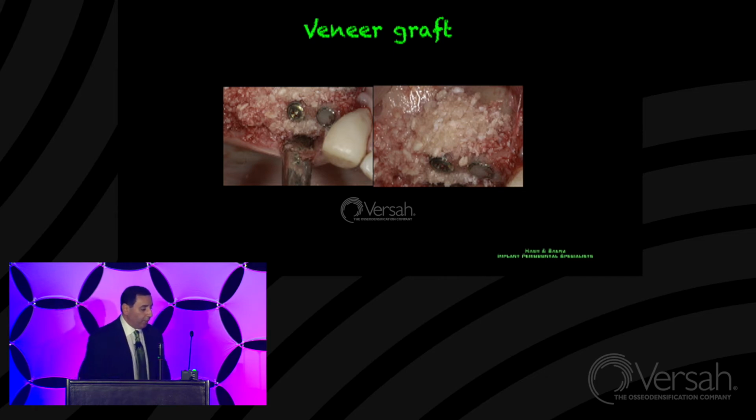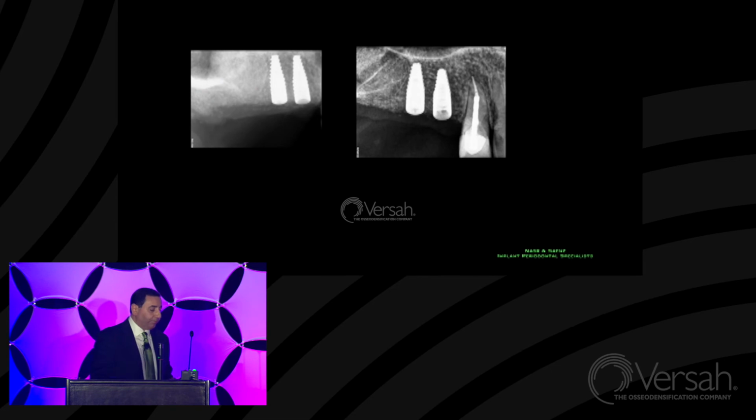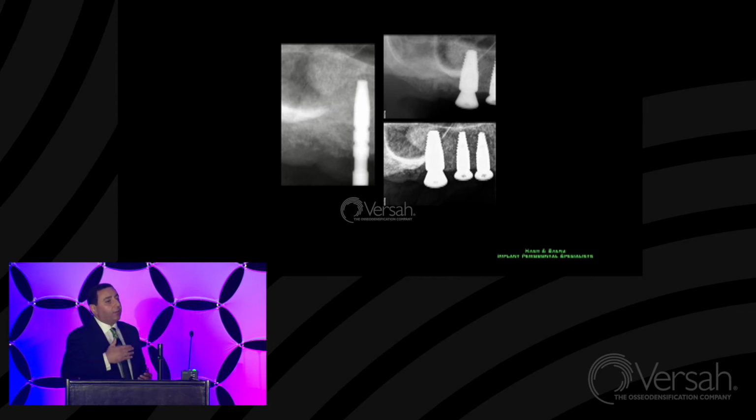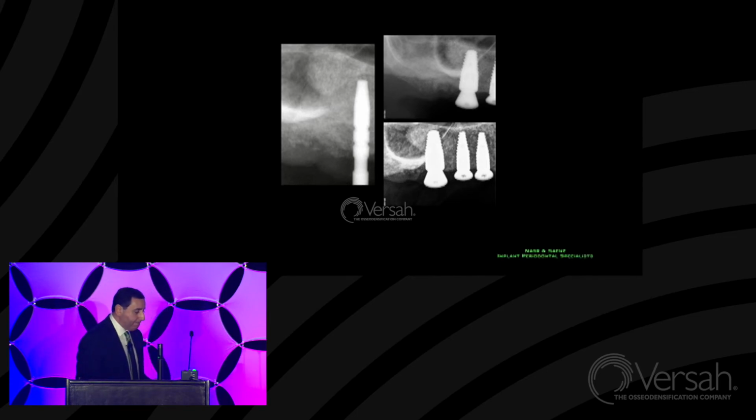X-ray and one during the surgical procedure itself. And you can see on the X-ray on the left the amount of maxillary sinus bone augmentation that was done, and now it's ready to receive the implant. Did I drill out that bone when I placed the implant in the molar position? The answer is no. I worked so hard to create that bone. It wouldn't make sense to drill out that bone. So now we are pushing that bone, densifying the bone into the sinus, into the augmented bone already, so you even get a better result, and your restorative time is reduced quite significantly.